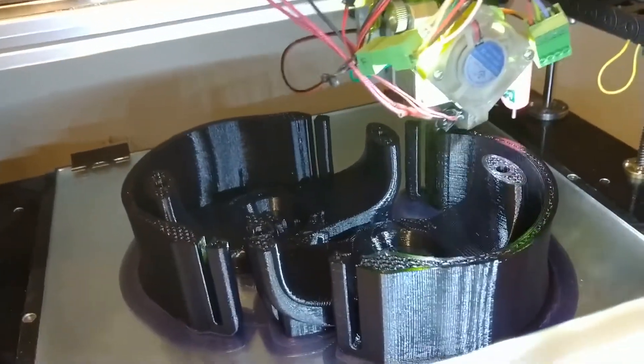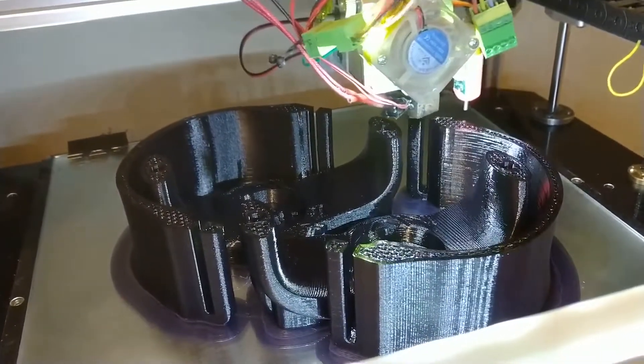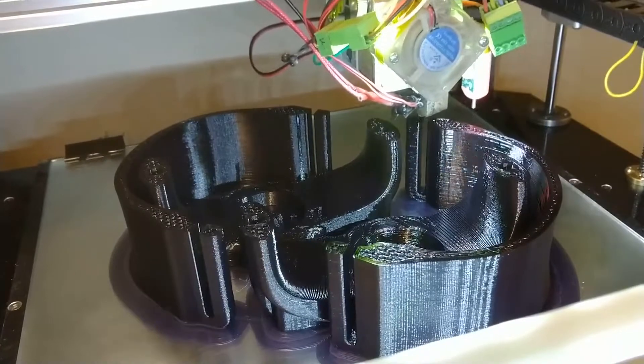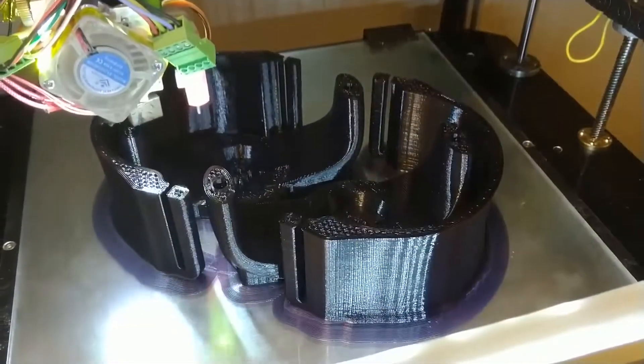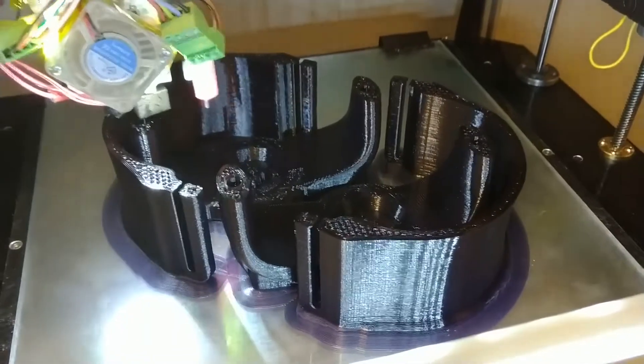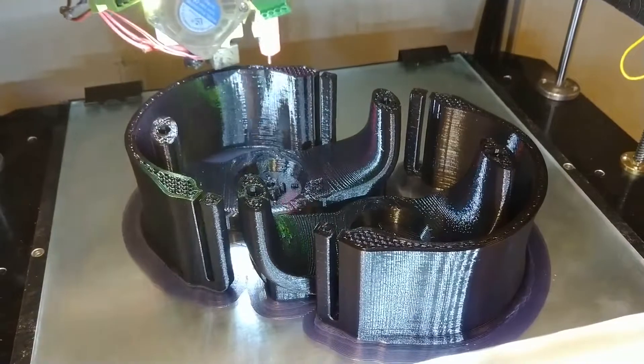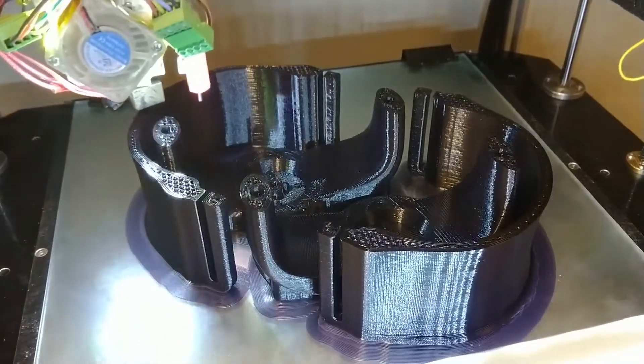The advantage is that without a whole lot of investment in molds and tooling, you can produce final end-result products that can be tested in the field. This particular final iteration proved to be exceptional.